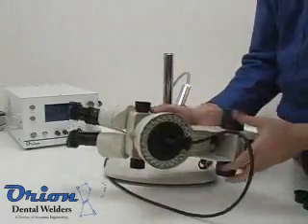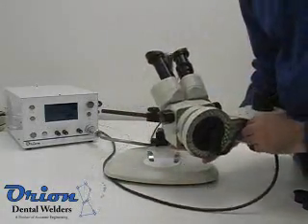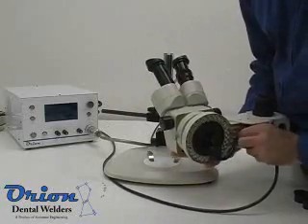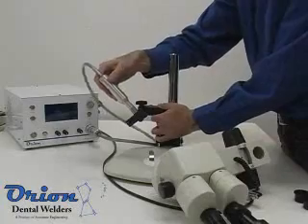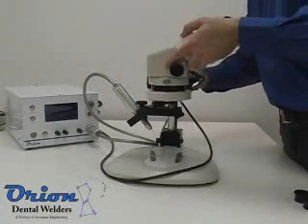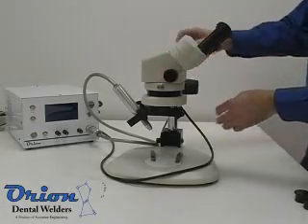Some Orion users prefer to bring their workpiece directly towards the welding stylus. This can be accomplished by simply turning the microscope 90 degrees and then adjusting the optics unit to face forward before locking it into place. Adjust the pulse arc stylus holder so that the stylus points forward at a downward angle.